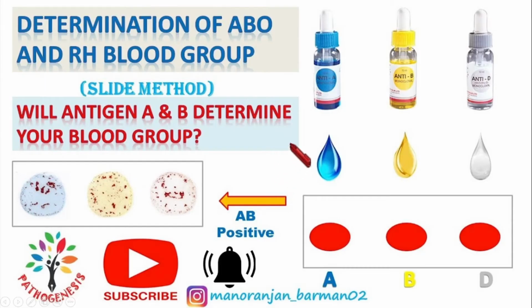Next, let's go and see how we determine the blood group. Here, for example, we took the AB blood group. As it is the AB blood group, we know that both antigens, A and B, are present here and there are no antibodies. This is the condition. And for determining the blood group, we need antisera: antisera A, antisera B and antisera D.